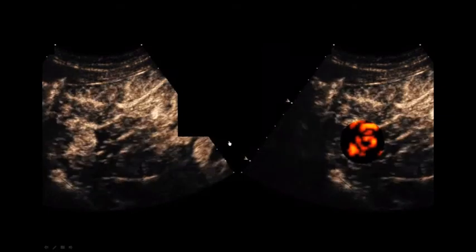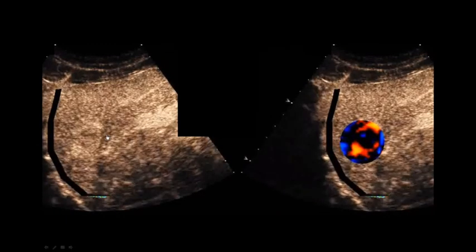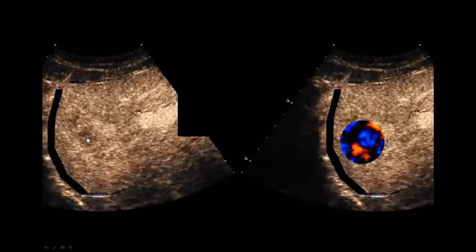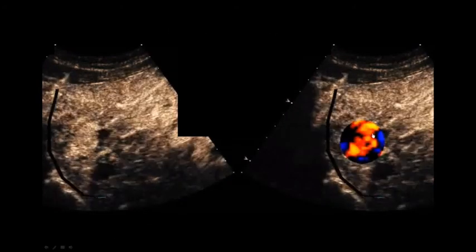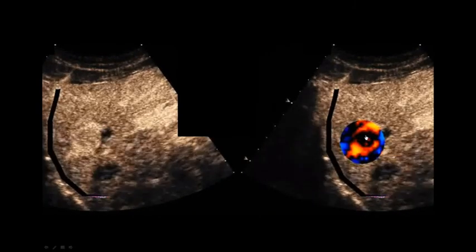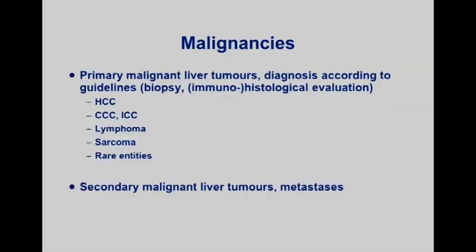I will show you in an image video. Here, hyperenhancement, portal vein is not enhancing, arrow on the left side. Right now, you see portal vein enhancement, and here, hypoenhancement of the lesion. So, it's within a very short period of time that you can see hyperenhancement due to arterial blood supply and the hypoenhancement due to portal vein blood supply. On the right side, I will show you hyperenhancement in orange, as I mentioned before, dynamic vascular pattern. Right now, the portal vein starts to enhance, and we can see quite nicely the hypoenhancing blue lesion, and this gives us a more distinctive feature that we can delineate: hyperenhancement, isoenhancement orange, and hypoenhancement blue.